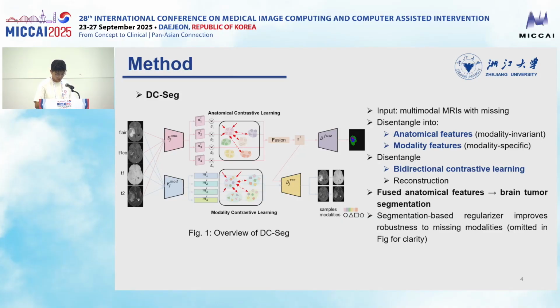After disentanglement, we fuse the anatomical features from the available modalities to perform tumor segmentation. Moreover, we introduce a segmentation-based regularizer to further improve the robustness.